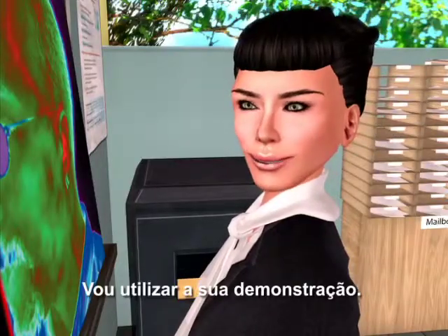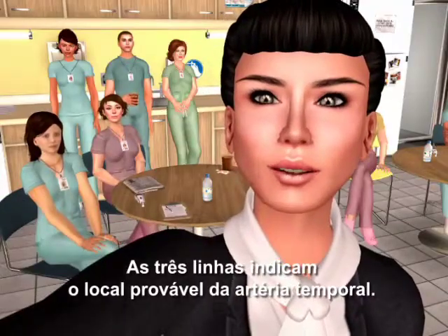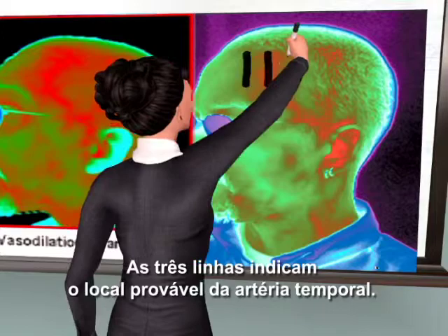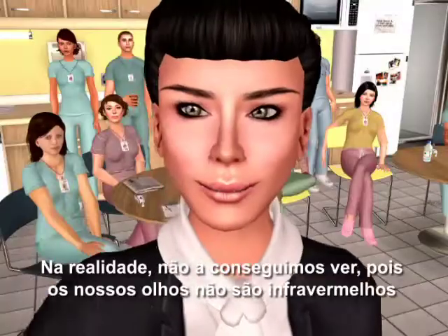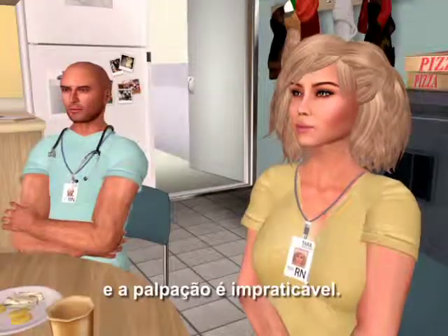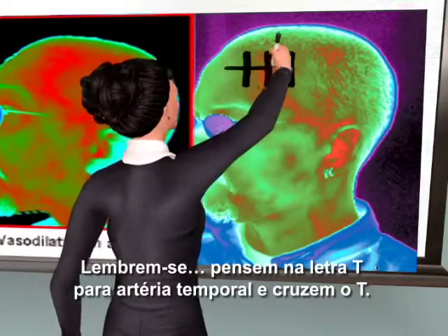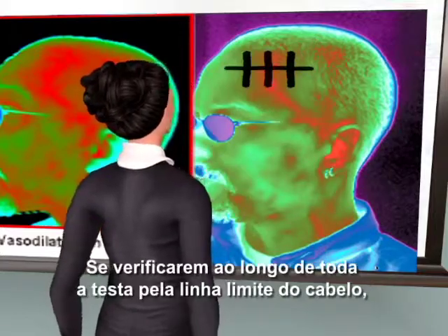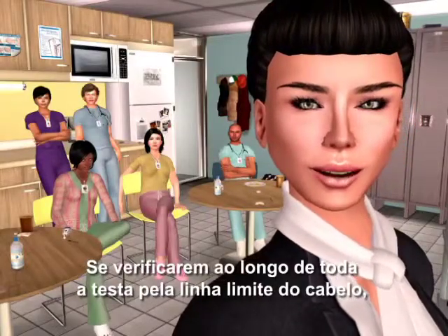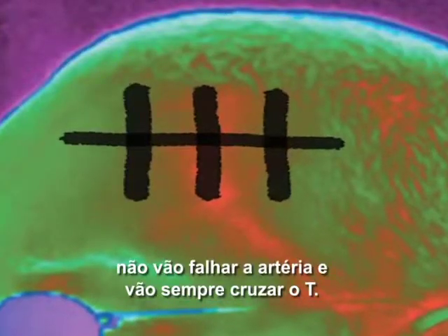I'm going to borrow your demonstration. The three lines indicate where the temporal artery might be. We can't actually see it, since we don't have infrared eyes, and palpating is impractical. Remember, think T for temporal artery, and cross the T's. If you can scan all the way across the forehead into the hairline, you cannot miss the artery, and you will always cross the T.